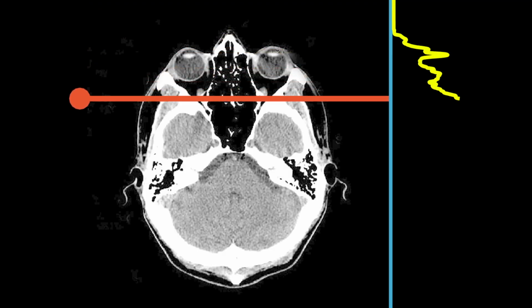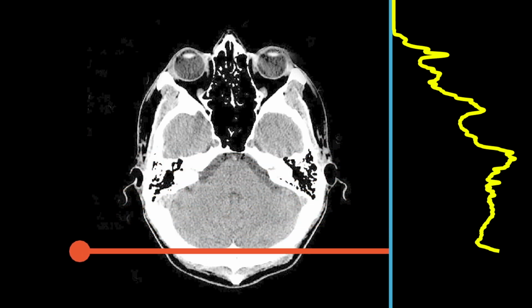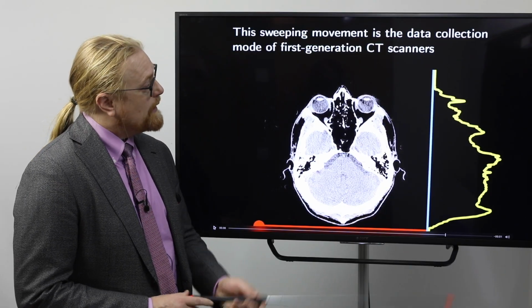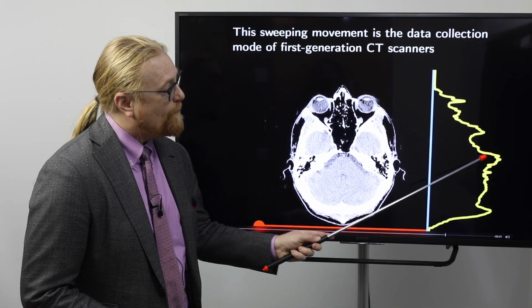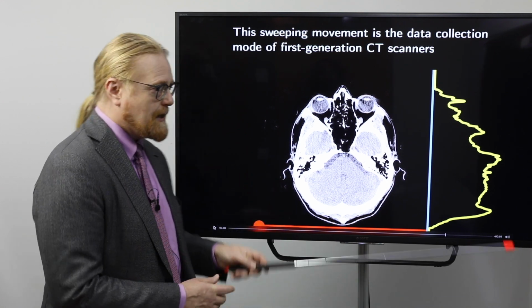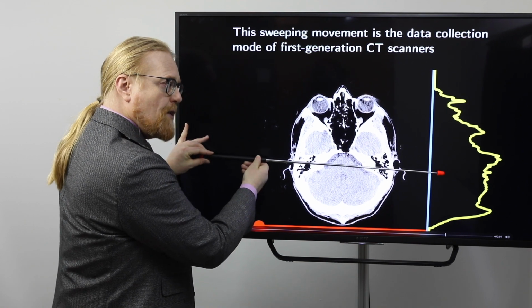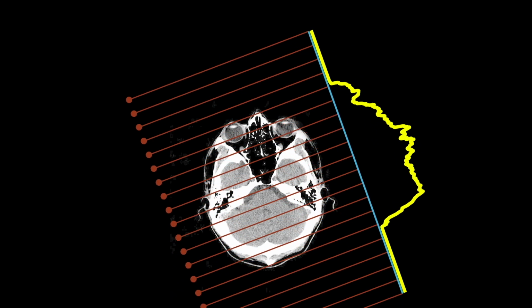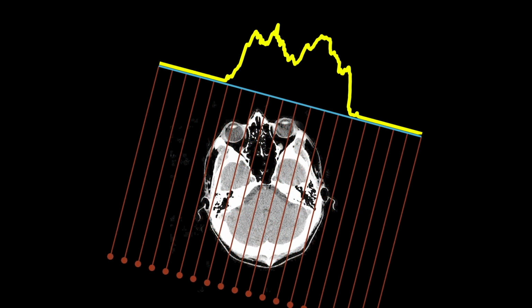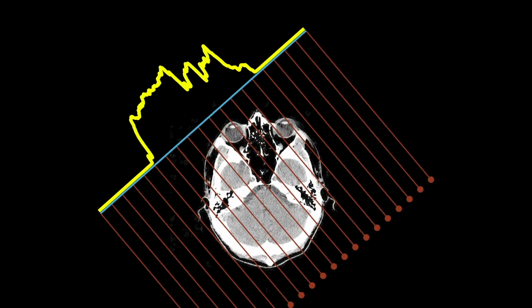A basic idea in slice imaging is to collect a lot of this information. So for example, with this kind of linear movement through the head, you collect such a profile of how much stuff was there through each of the X-rays traveling in this direction. Then an important part of tomography is rotation. We collect the profile from all directions around the patient.